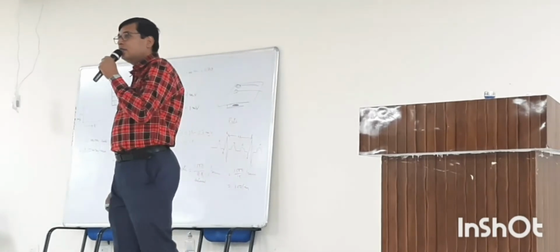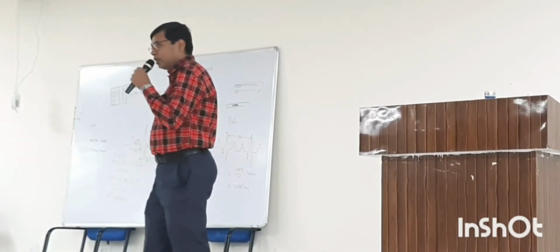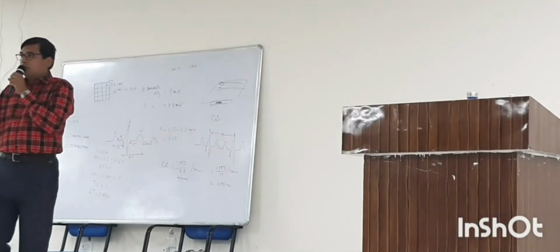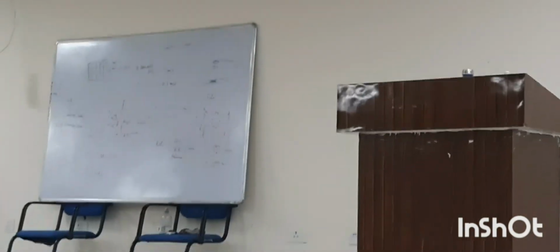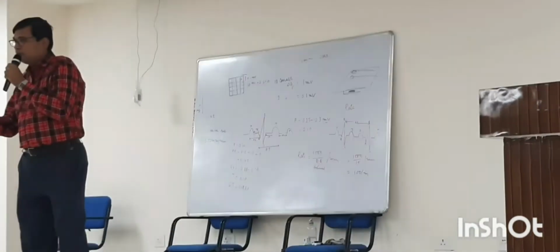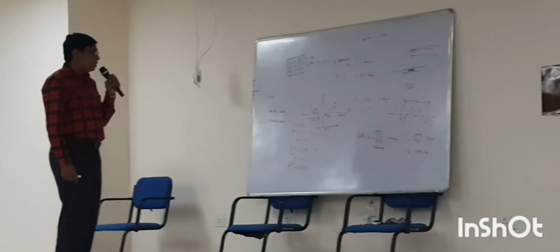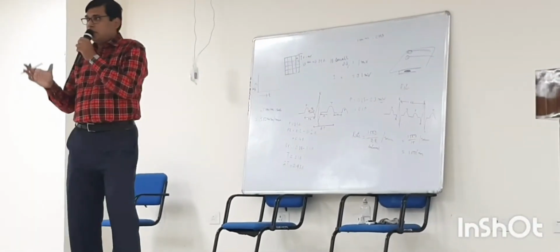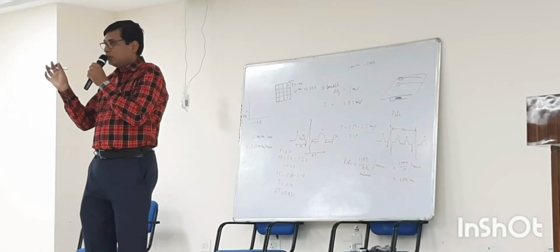Second point is rhythm. Right? You have to tally two successive RR intervals. In sinus rhythm, during inspiration, the RR interval decreases or heart rate increases.